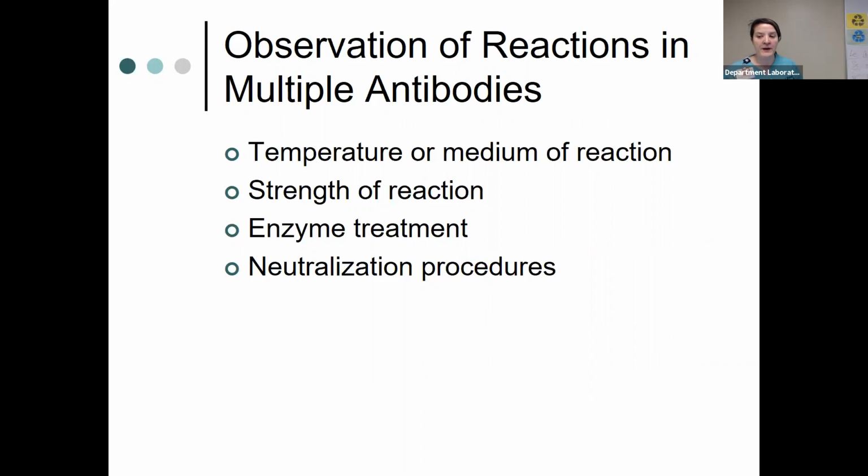So it's very important you pay attention to the temperature of the reactions. Is it only reacting at AHG? Is it only reacting at initial spin? Is it reacting at 37 and AHG? Those are some clues that help you hone in on which antibody you might be dealing with.